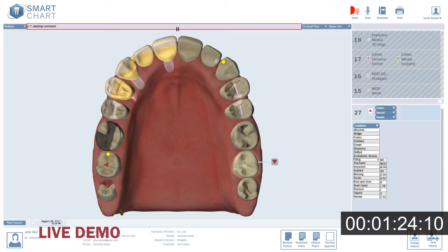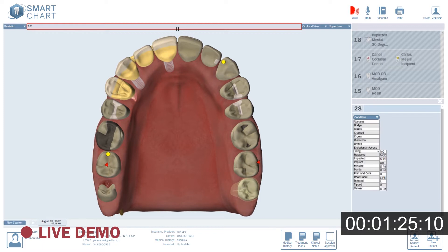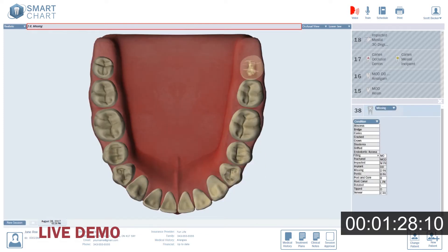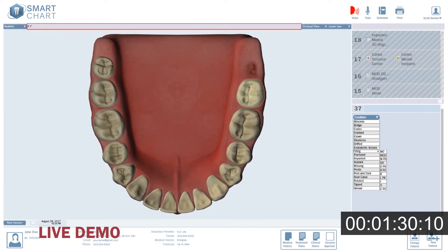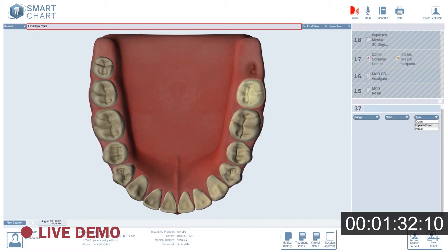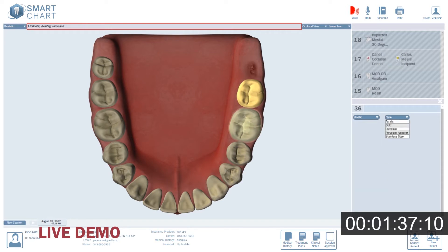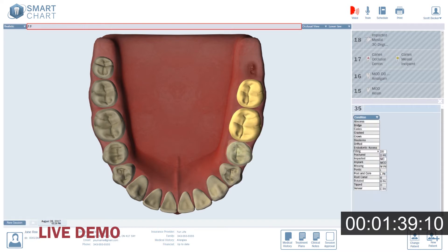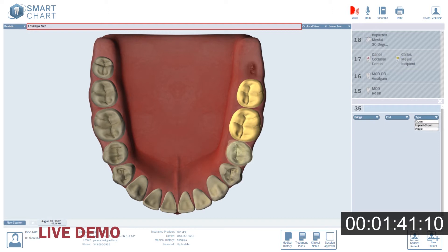2.8: Missing. 3.8: Missing. 3.7: Bridge start, crown, gold. 3.6: Pontic, gold. 3.5: Bridge end, crown, gold.